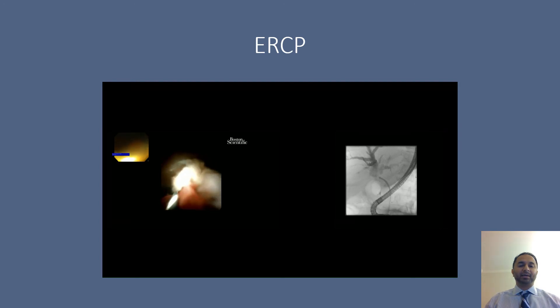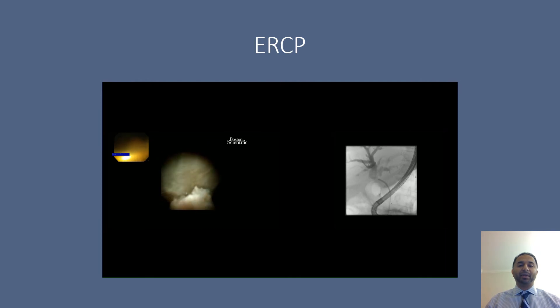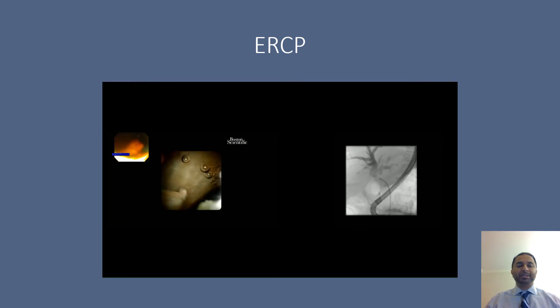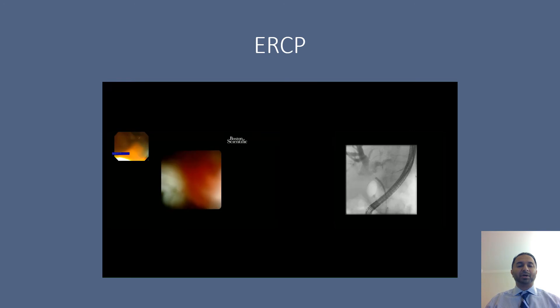In this case, the left hepatic duct was not easily accessible, so the cholangioscope is advanced to the hilum, and then the bifurcation is seen. On the right-hand portion of the cholangioscope images, you can see the takeoff of the left hepatic duct. A wire can then be advanced into the left hepatic duct, as you can see on the fluoroscopy images on the right.